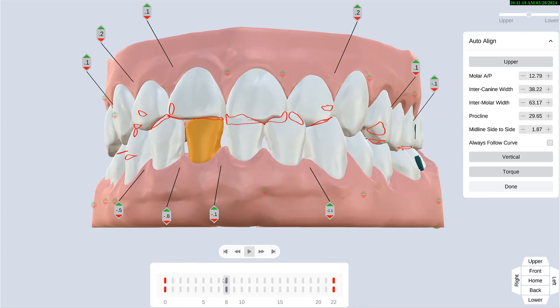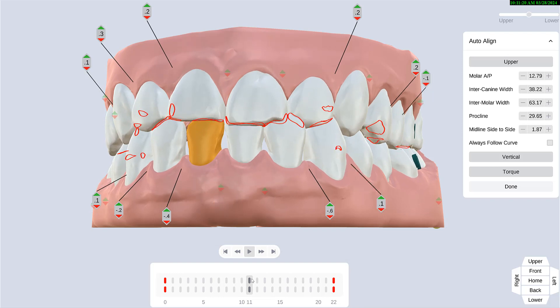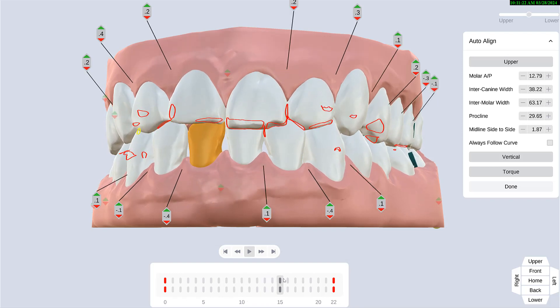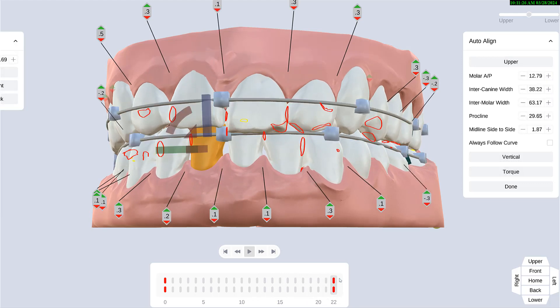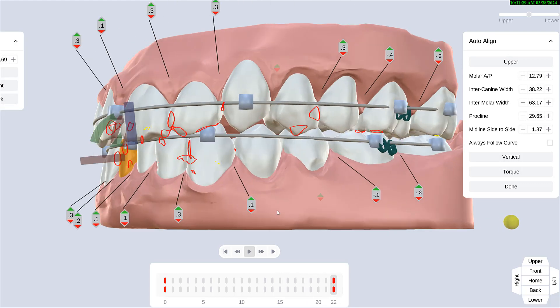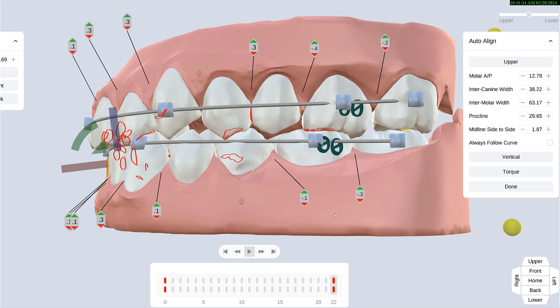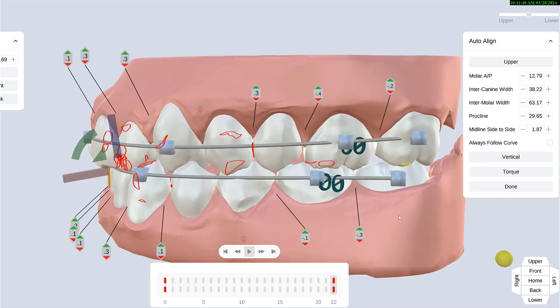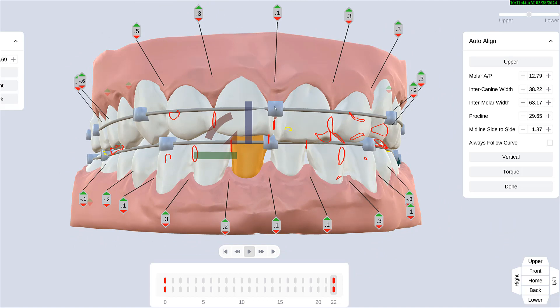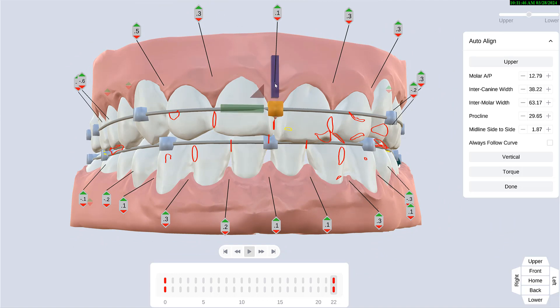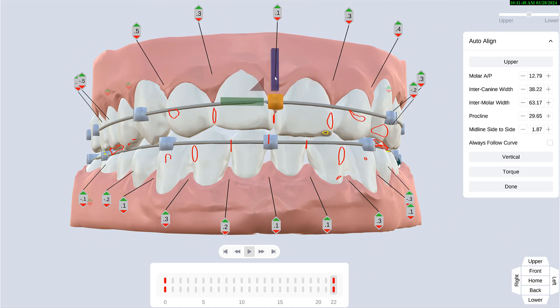You can see immediately that I'm moving the teeth by advancing the steps. This is based — same as DIVZ-AI for fixed orthodontics — entirely on the straight wire concept, which may not be applicable for all cases, but it's still pretty nice. You can click on this and modify the vertical.